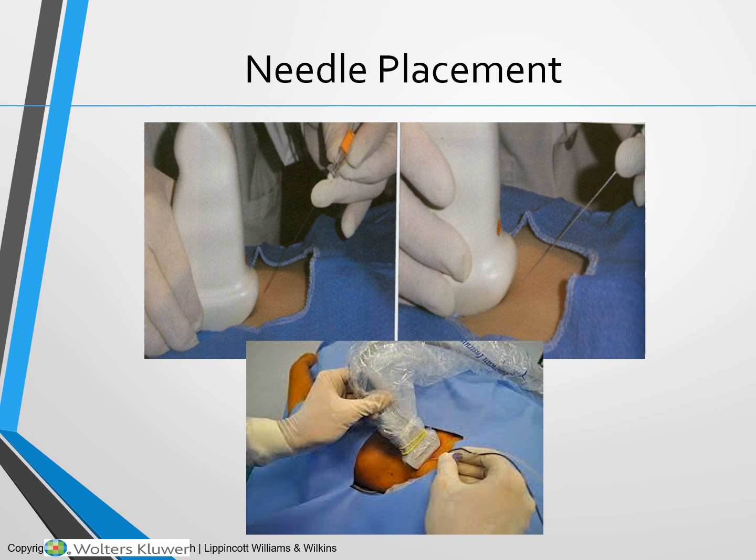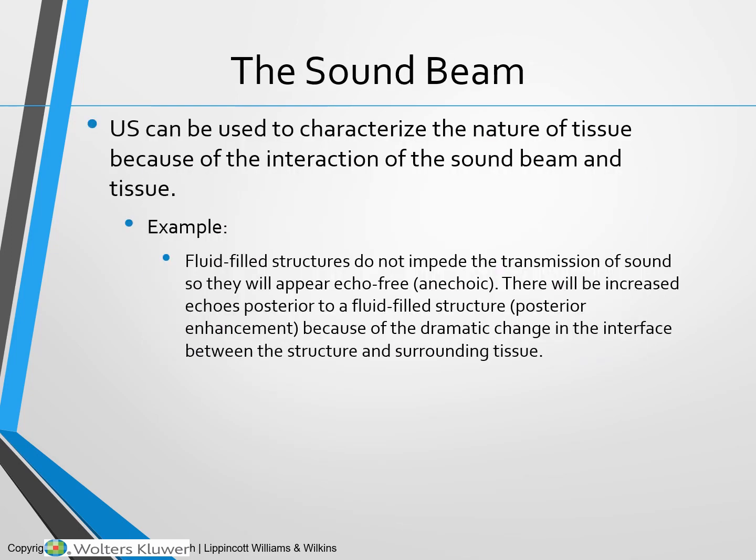Here are just some images showing what that setup might look like with the use of the ultrasound probe and a sterile field, and then how we direct the needle to be in line with the ultrasound probe so that way we're able to see that on our image.